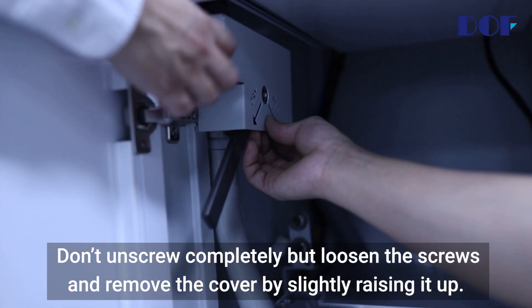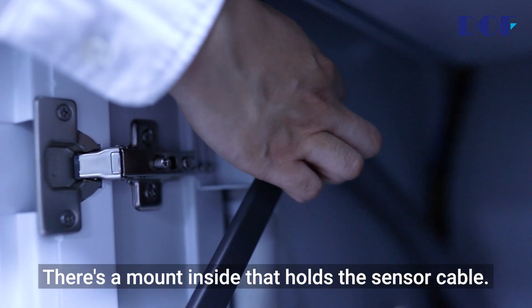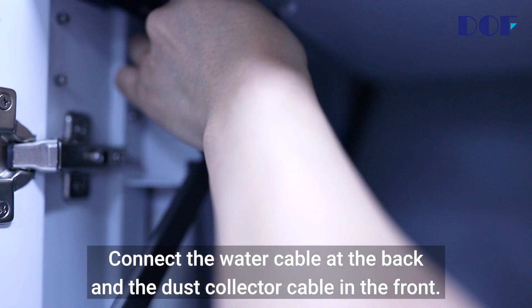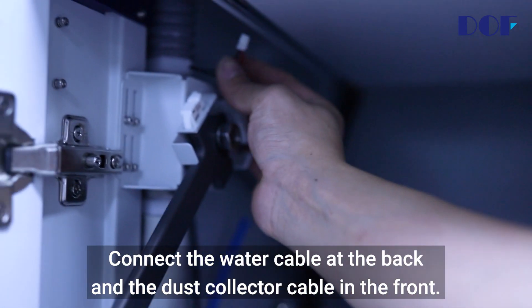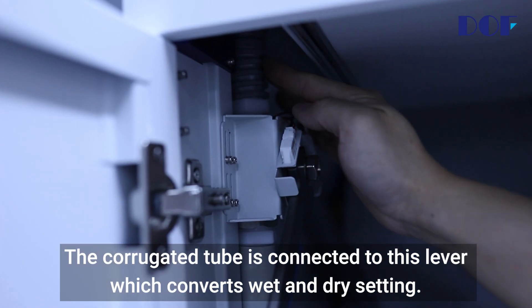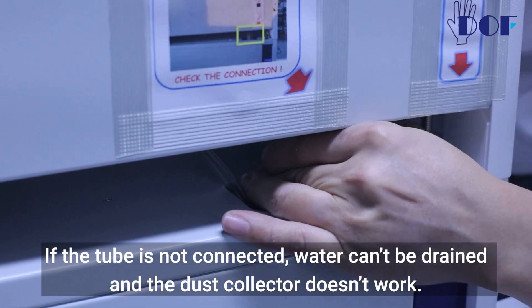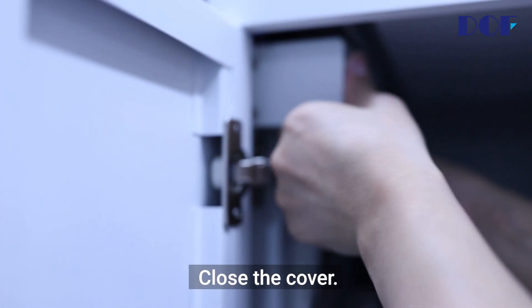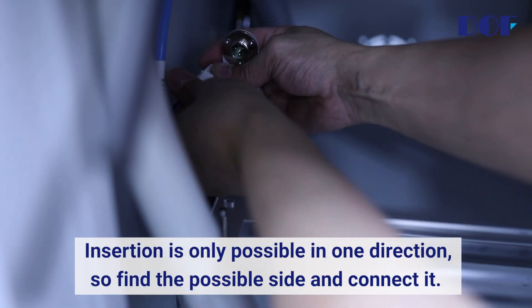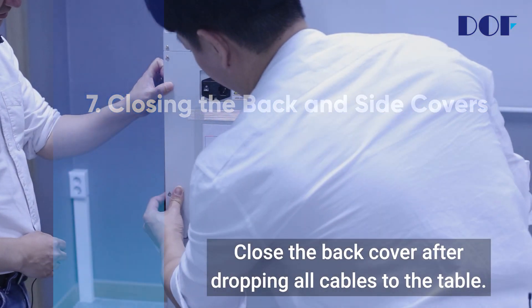Don't unscrew completely — loosen the screws and remove the cover by slightly raising it up. There's a mount inside that holds the sensor cable. Bring up the cables. Connect the water cable at the back and the dust collector cable in the front. The corrugated tube is connected to this lever which converts wet and dry setting. If the tube is not connected, water can't be drained and the dust collector doesn't work. Close the cover. Connect the water pump power cable to the connector — insertion is only possible in one direction, so find the possible side and connect it. Close the back cover after dropping all cables to the table.